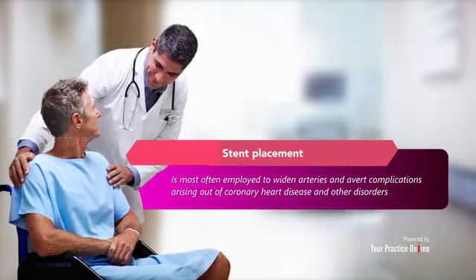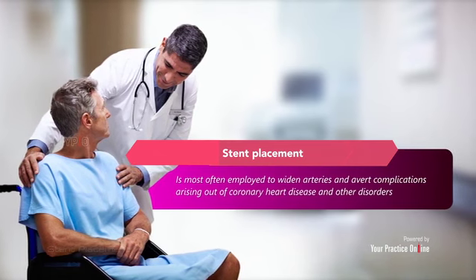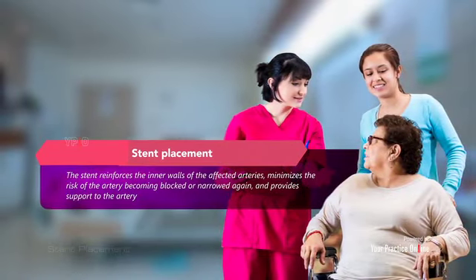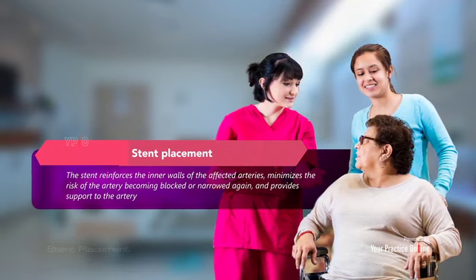Summary. Stent placement is most often employed to widen arteries and avert complications arising out of coronary heart disease and other disorders. The stent reinforces the inner walls of the affected arteries, minimizes the risk of the artery becoming blocked or narrowed again, and provides support to the artery.